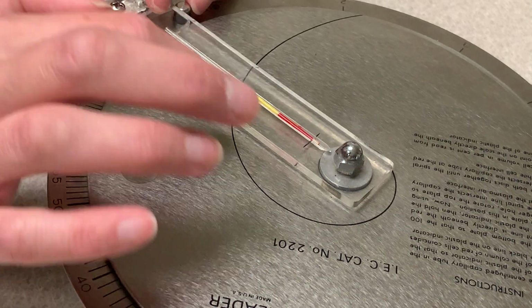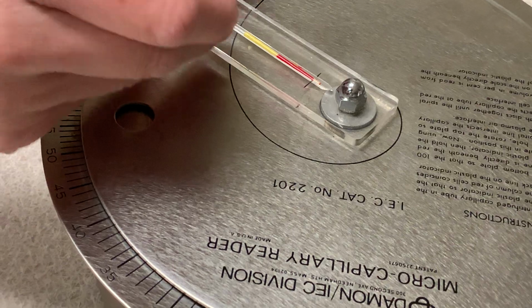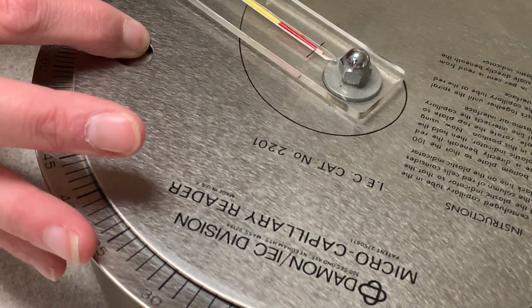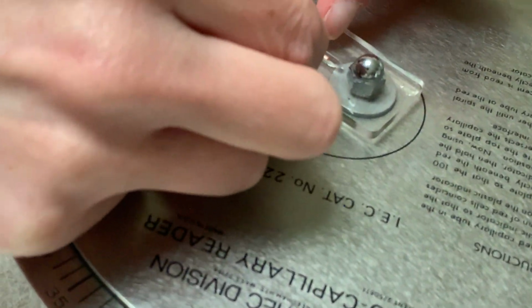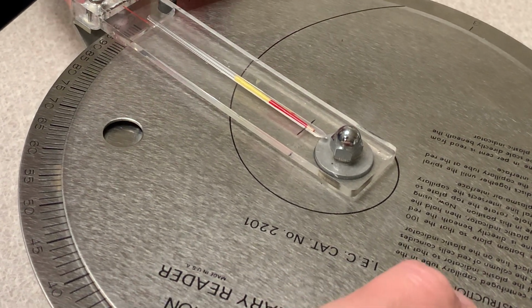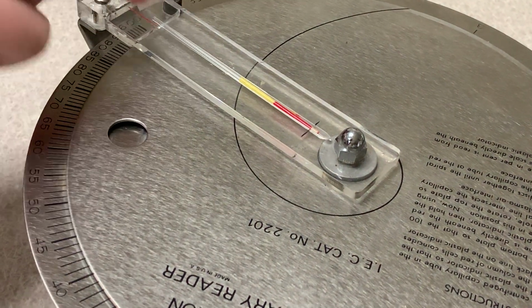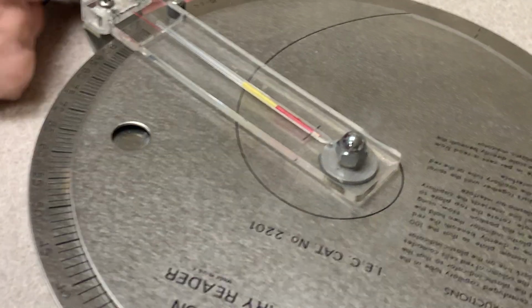And then the swirled line is going to be kind of our upper level. We don't want the air in our ratio, right? So we're going to move the black line so it's in between the plasma and the air in the tube. So now we've got just the red and the yellow that we're going to get the ratio between. So there's 3 steps we've done so far. We've taken out the clay, we set it to 100, and we took the air out, right?